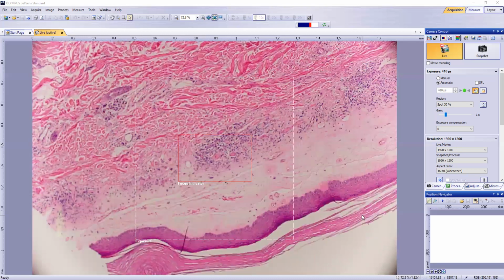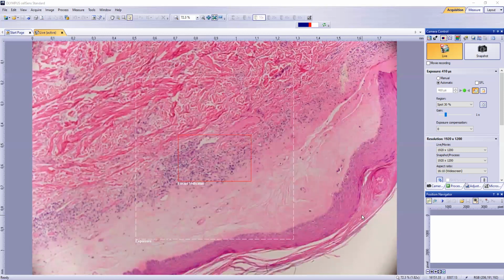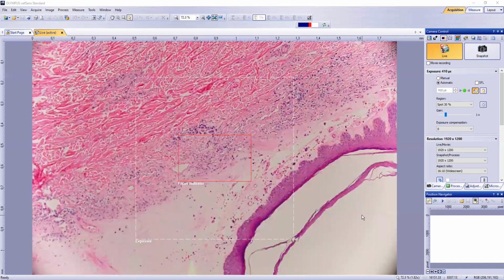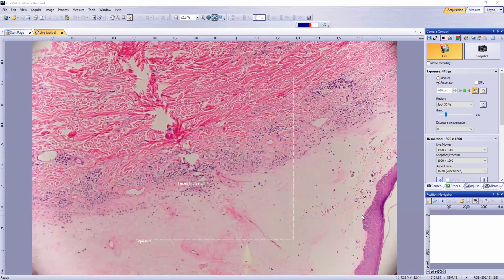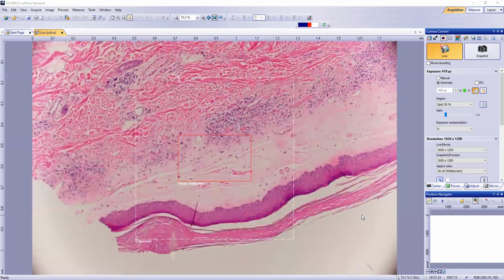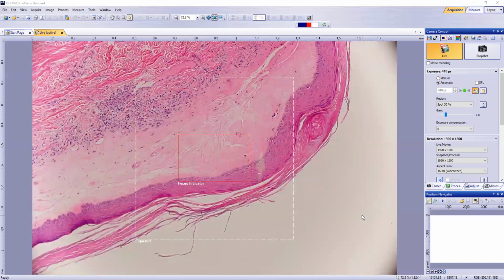So you'll see this nice sort of band-like infiltrate of lymphocytes beneath a zone of pale pink homogenized sclerotic collagen containing ectatic blood vessels. And in some instances, you'll see extravasated red blood cells too within these zones of sclerotic collagen. And then beneath that, again, you have that band-like infiltrate. In very early lesions of lichen sclerosus atrophicus, that band-like infiltrate is right up against the dermal-epidermal junction. And the vacuolar alteration of the epidermis tends to be much more striking in those early stage lesions.